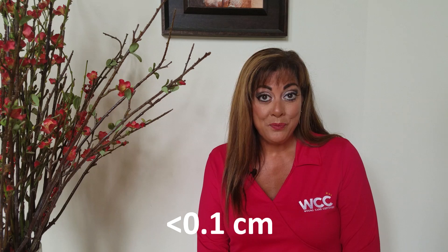So, if I had to measure depth and I had slough and eschar in the way, this is what I would do: write the less-than sign, 0.1 centimeters. That shows that you have an open, active wound. As you use the right product and start debriding, that depth will increase.